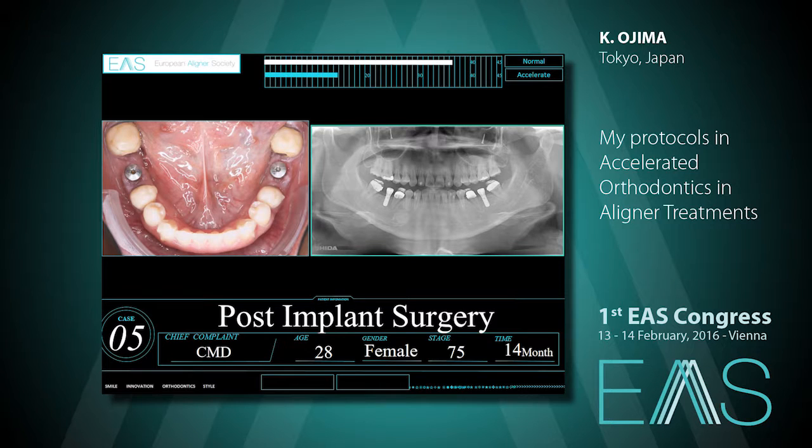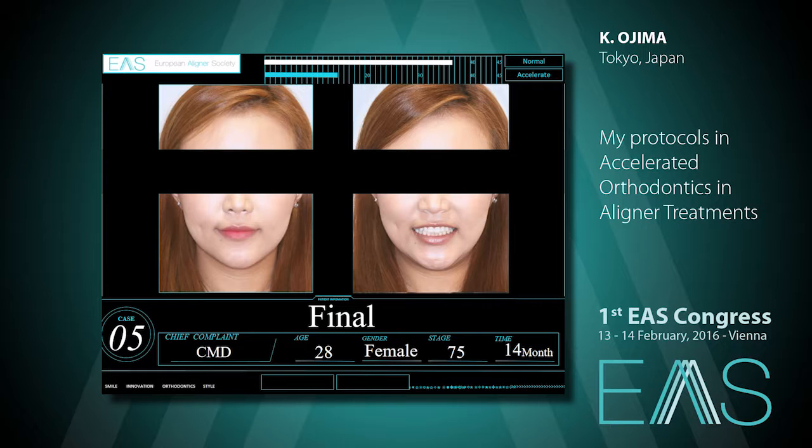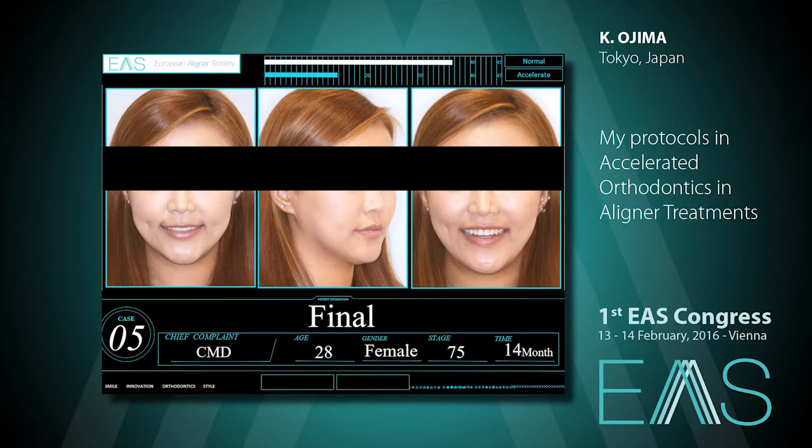The post-implant surgery. The interdisciplinary dentist set the final restoration. Final. As you can see, the midline is correct. The class 1 relationship is achieved. This is the final for the extraoral findings. The facial midline shift is completely improved and ideal guidance is achieved, and the patient is in a pain-free position.